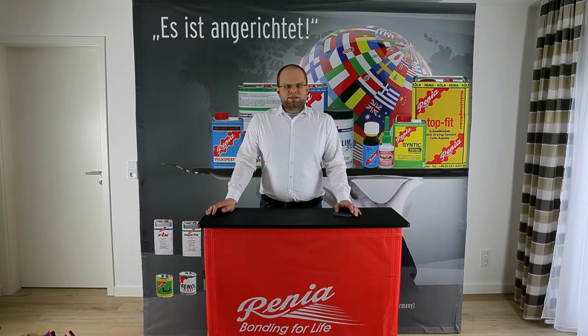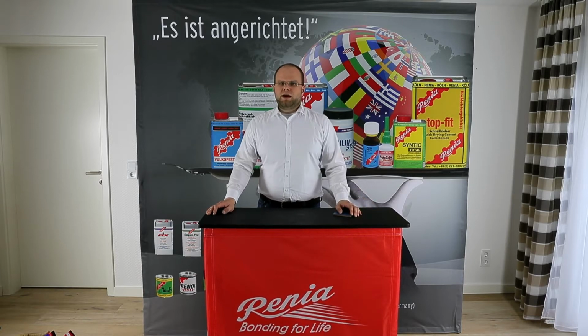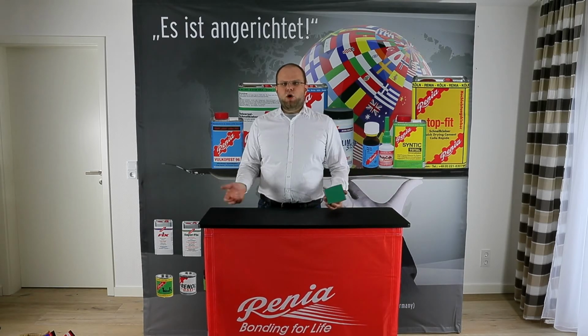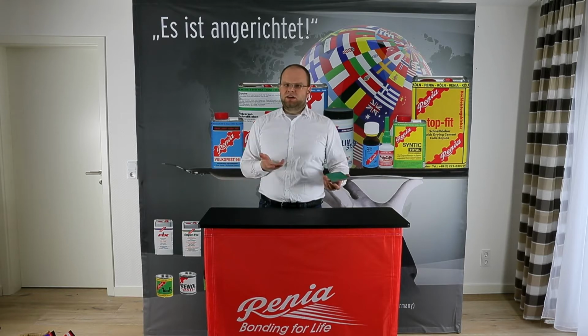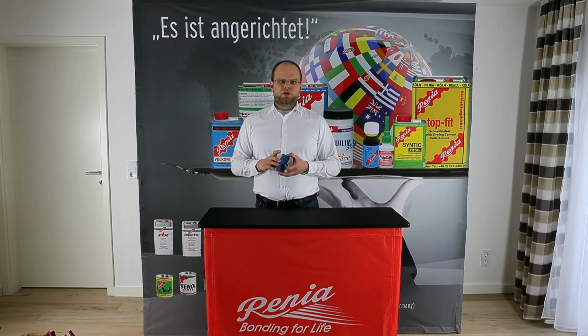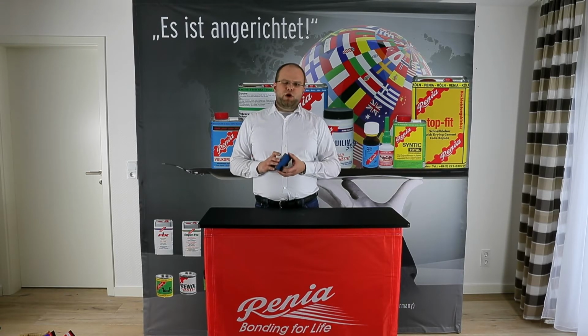Sometimes it's called PPT, sometimes it's called Poron, sometimes it's called polyurethane sheets, PU sheets, PU foam. It's simply a matter of which one you're using, and they all handle pretty much the same. Of course, there's differences in the application, in density, in hardness, in how they wear, but as far as bonding is concerned, we can all treat them in the same way. There's certain things you need to be aware of when bonding this material.